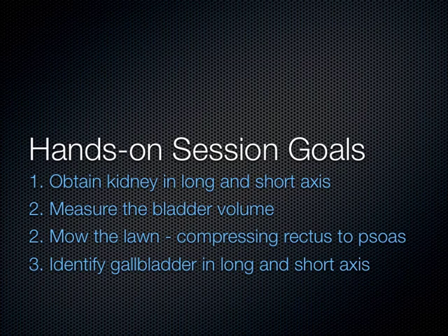It does something too with the lateral abdominal wall muscles maybe, brings those in a little bit tighter so you can use them for compressibility. Brings the contents of the abdominal cavity, the intestines, a little bit more anterior, so you're compressing anteriorly and not laterally coming from the side. That's the only thing I can think of. I get that question all the time, and that's how I think of it. It just brings everything together a little tighter into the abdominal compartment.